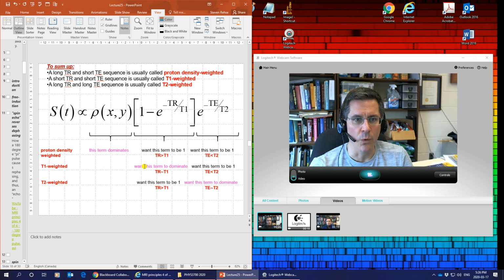What if I want T1 to dominate? I need this term right here to dominate. I need TE to be much less than T2 in the same way. That way this term is always 1, because e to the negative something small, close to 0, is essentially 1. This term now is not 1 or 0. It actually is something measurable. I need TR on the order of T1. So this thing is not 0 or 1.